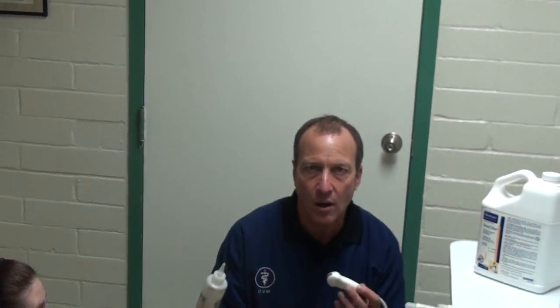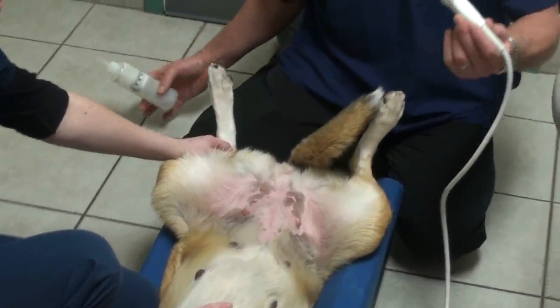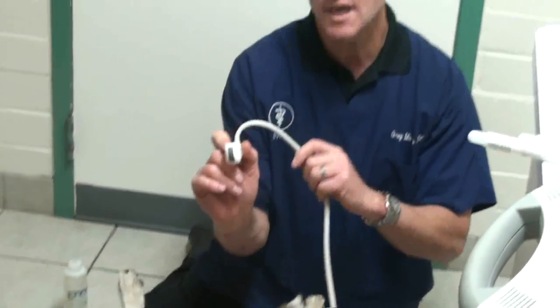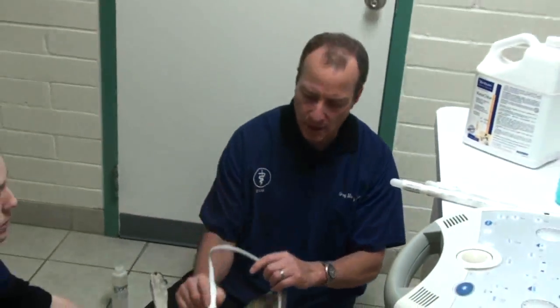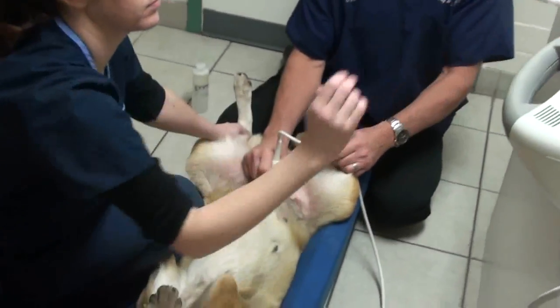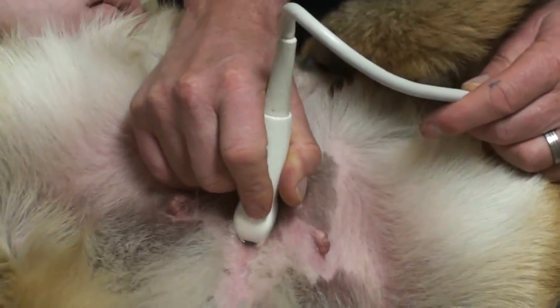We're putting on a little alcohol, and what that does is make the probe go down onto the skin without air interfering. Then we put the probe on there and run it up and down the belly to see the organs inside.